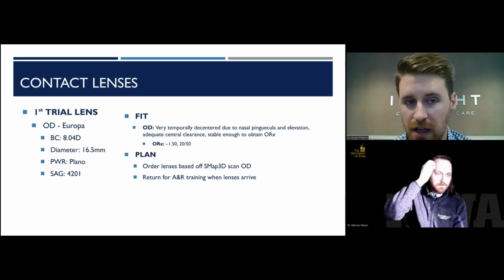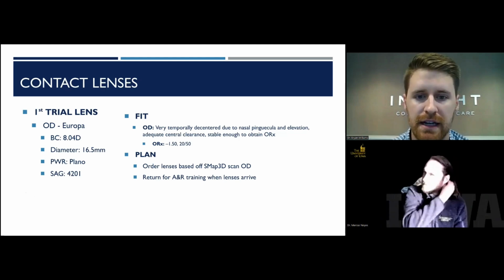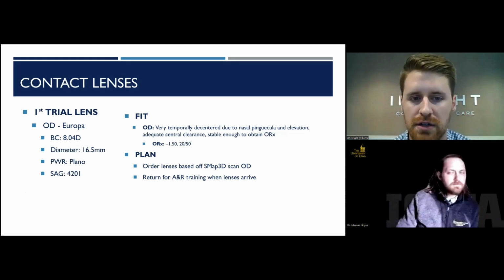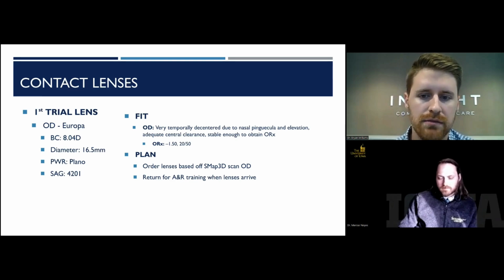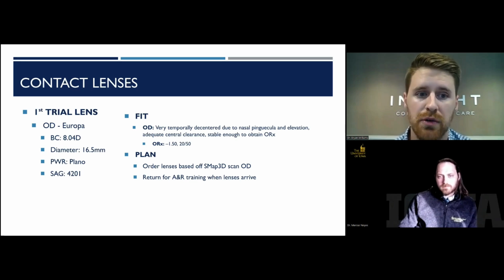So this one was another one that I almost didn't even give an option of a diagnostic fitting. The area around his nasal conjunctiva was so irregular from the scar tissue and where he already had a very large pinguecula that I didn't think we would get anywhere near a decent result without starting off with, or we potentially could if we got real complicated or real creative, but SMAP I thought would get to an end result much, much quicker.